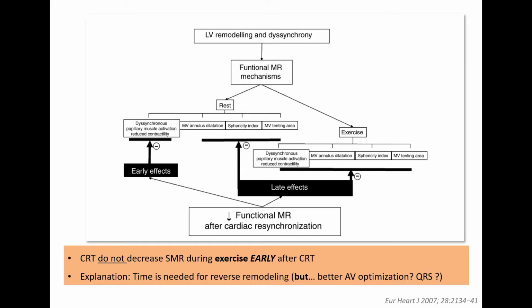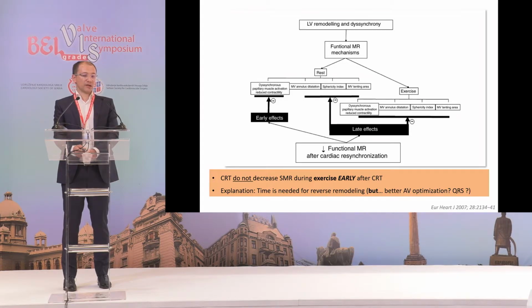Međutim, bolja AV optimizacija može da dovede, siguran sam, i do ranih odgovora u ovom smislu, a u studiji nije analizirano kako izgleda QRS. Studija je iz 2007.